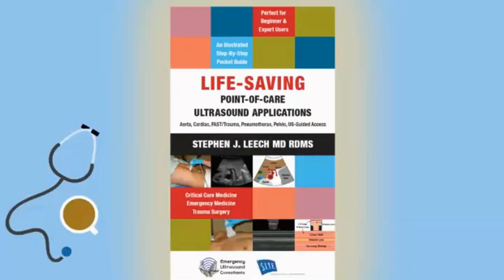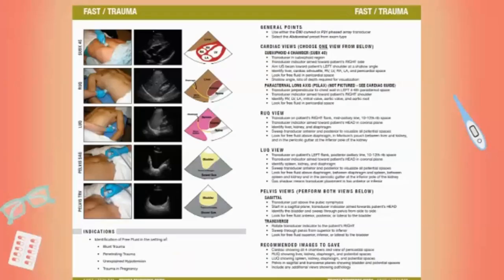So I just wanted to use this as a reference. This is a great guide that one of the guys from Helen Joseph actually suggested to me. They've got this in their ED. It's a little handbook, a pocket guide that's literally 4 pages long. And it's great because it's got all of your quick point of care ultrasound applications in it. So it's not just your EFAST, it's got a whole lot of stuff in it. This is a nice summary. It literally is everything that you need to look for in an EFAST on one page.